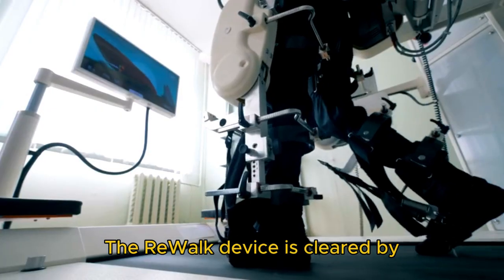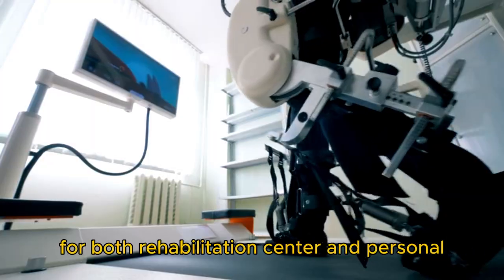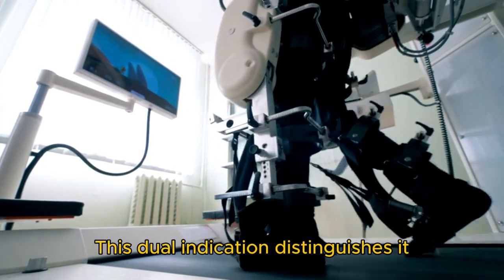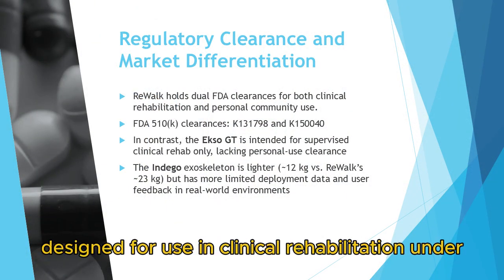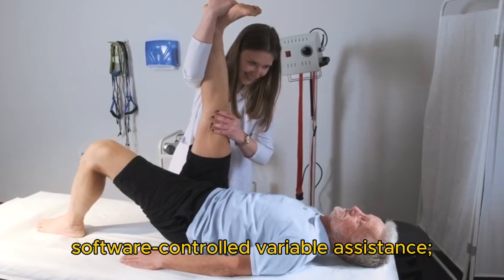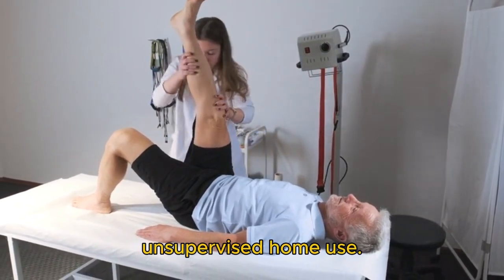The ReWalk device is cleared by the U.S. Food and Drug Administration (FDA) for both rehabilitation center and personal home and community use. This dual indication distinguishes it from several competitors. For example, the EXO-GT is primarily designed for use in clinical rehabilitation under therapist supervision and includes software-controlled variable assistance; however, it lacks FDA clearance for unsupervised home use.